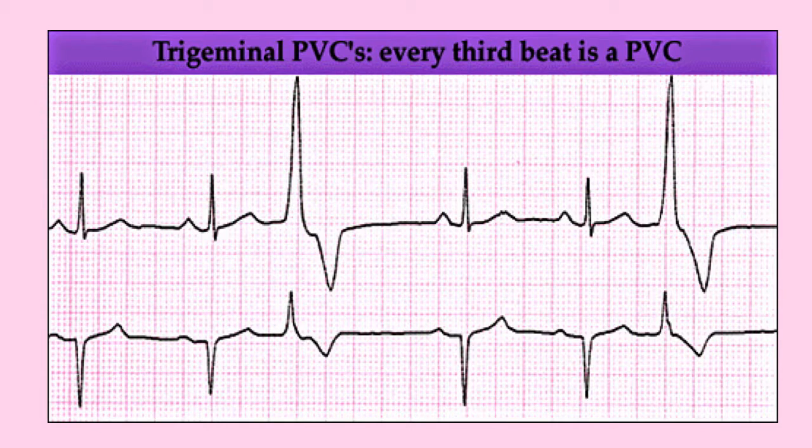There's an inverted P wave with an upright QRS complex, and that inverted P wave means that it's a junctional escape beat. It's only one, so it's a beat, and if you're thinking back to a few minutes ago, that's an upper junctional escape beat. And then at the bottom, you have a pause coming in. You have a big wide beat, no P wave, and this is a ventricular escape beat, again, a single beat. And again, this pause is not a good situation, but at least there's something backing it up.